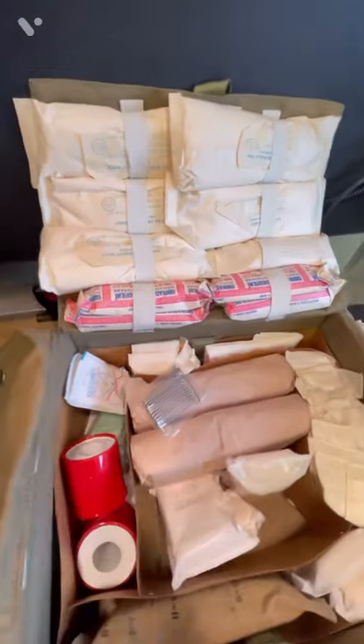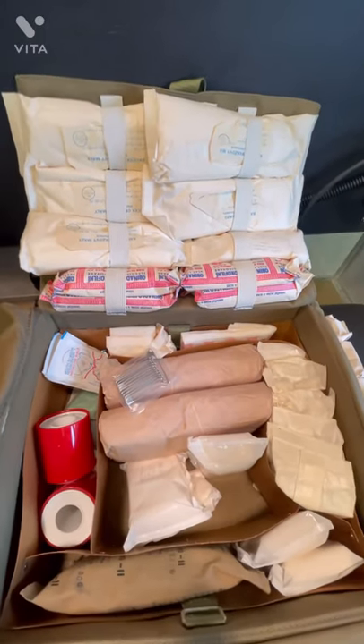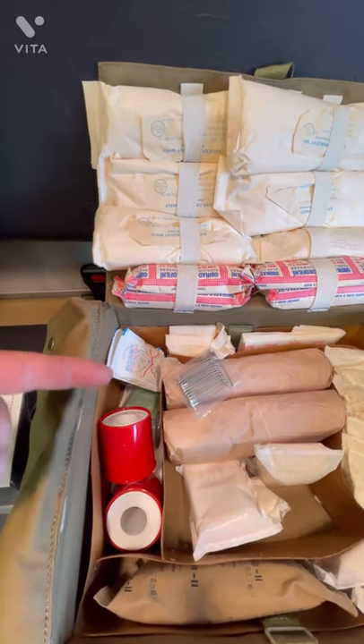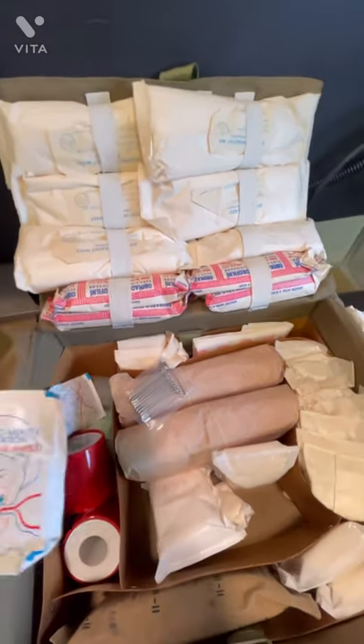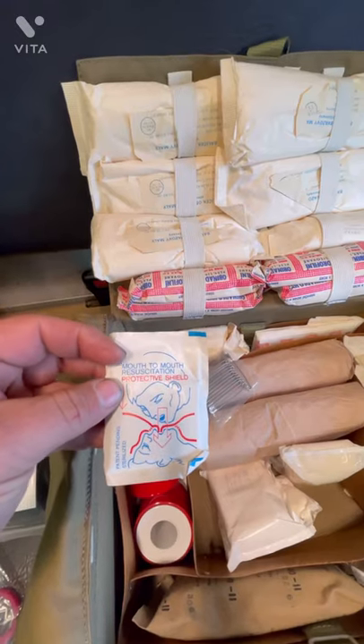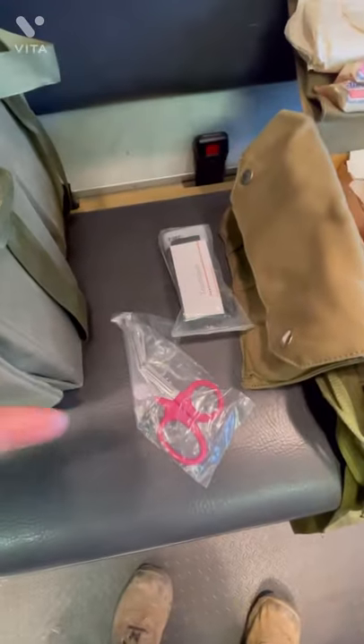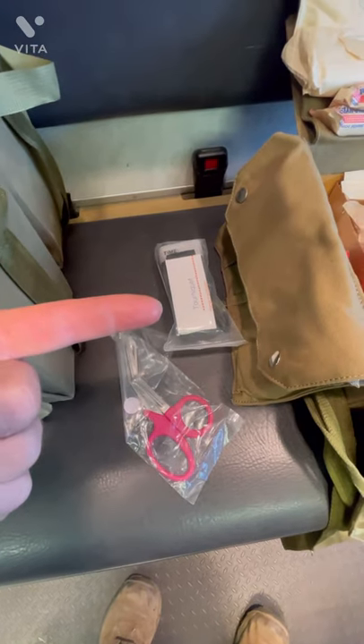They come with all sorts of stuff — several different types of gauze. You've got band-aids, you've got a little bar of soap, ace bandages, there's some mole skin underneath there. These dudes right here — mouth-to-mouth resuscitation protective shields, gauze galore. I'm also going to throw in a set of medical shears and a single-handed tourniquet.